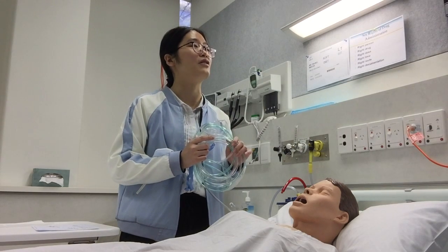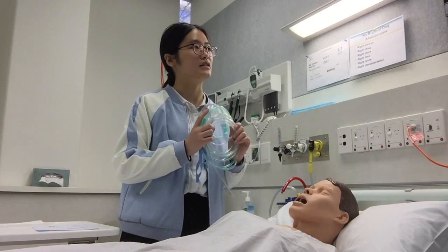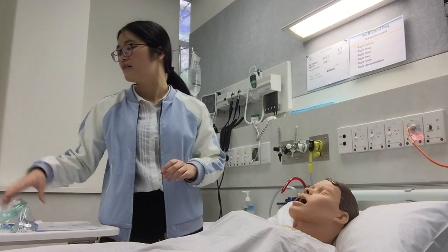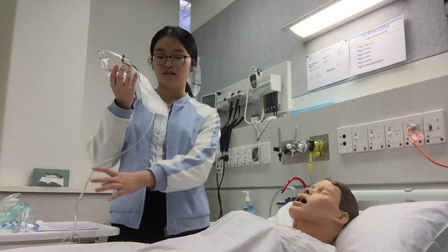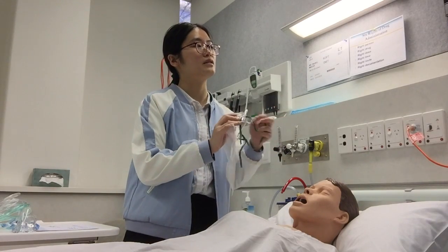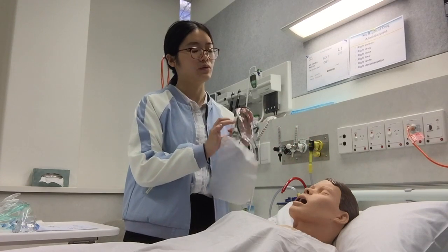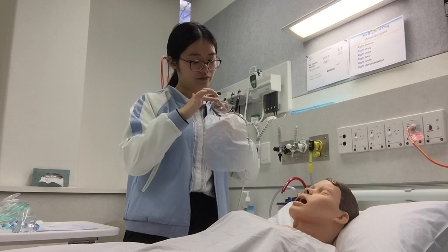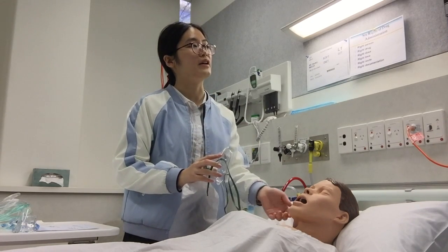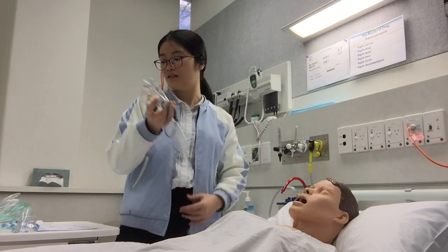No, definitely not, right? So if the patient is discharged, you need to put this one into the bin. It can't be reused. And for the same patient, do you think it's okay to keep this one if we don't clean it? So we always make sure the area around the mask is clean, and keep the patient's face clean to prevent infection. Okay.